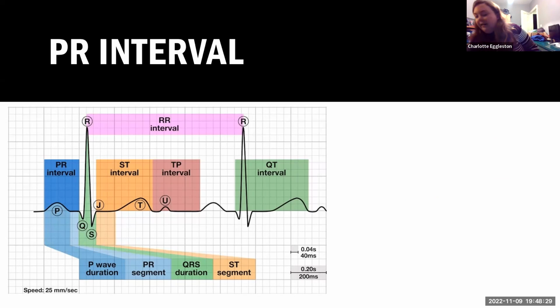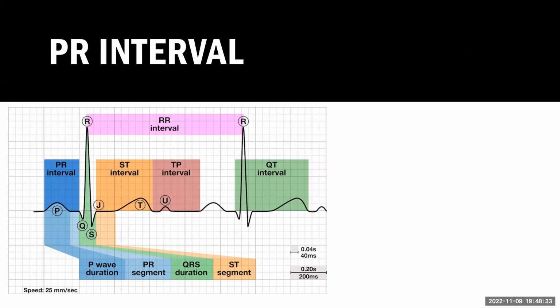So shout out anything, any point if you need. So then we come on to the P. I have a quick question. Yeah, go for it. Why is it that it's the second limb lead that's used as, or second chest lead that's used as the 10-second strip?